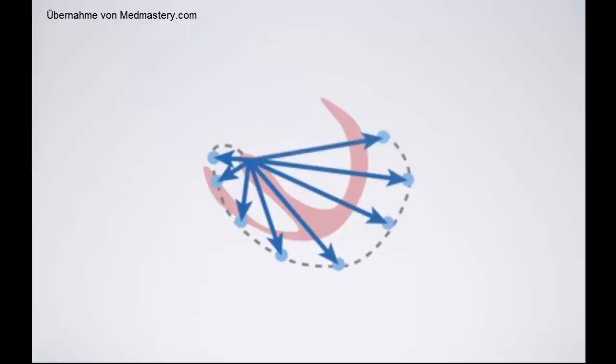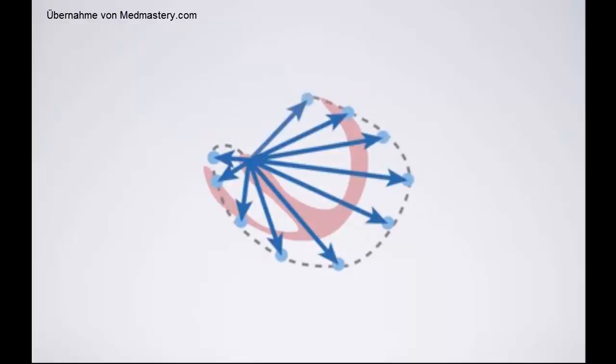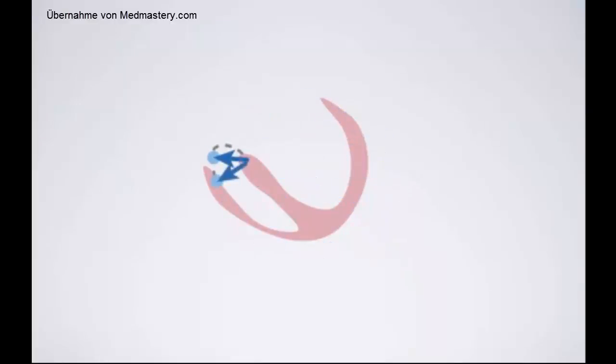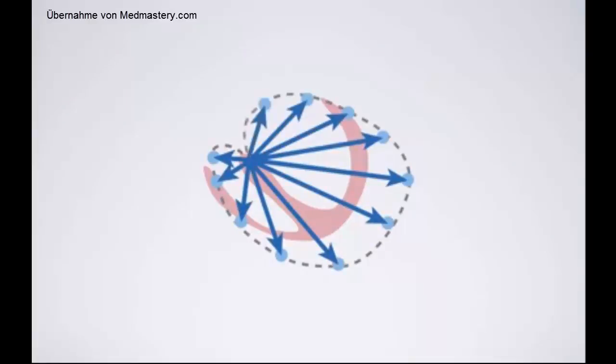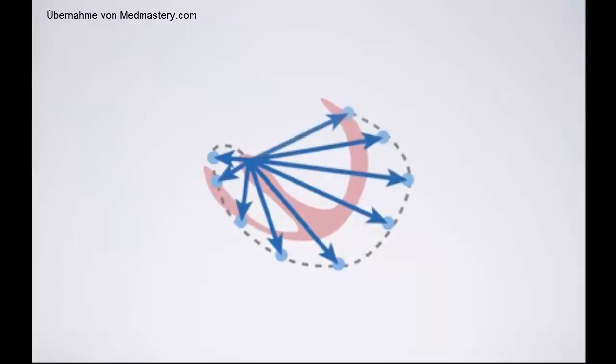With the complicated geometry of the ventricles, you can imagine that at each point in time, there are vectors of different amplitudes showing into different directions in the heart. From all these momentary vectors, an average vector can be constructed for each point in time. The sequence of these average vectors over the time of ventricular depolarization enables us to construct the vector loop, which you can see here. The vector loop is the line that connects the tip of the arrows here.